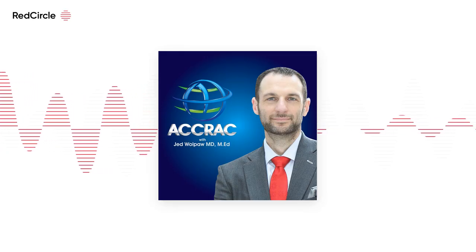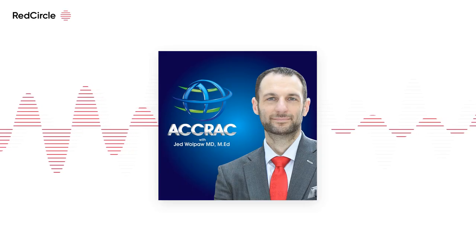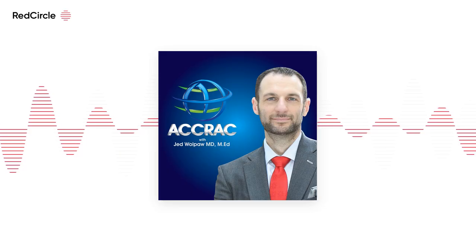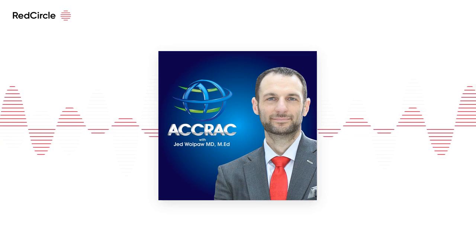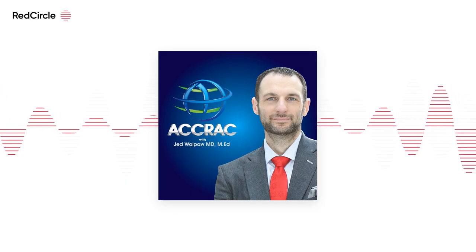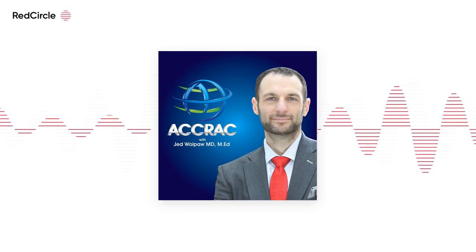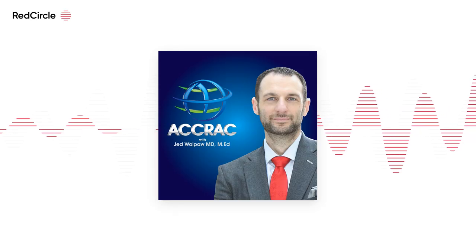What it does is have you do a decremental PEEP trial, just as we mentioned before. You start high, and then you go down to the lowest PEEP level. At each level, it measures the change in impedance that occurs. If you have a device that also knows the pressure, it calculates the compliance of each region of the lung as well as your total respiratory system compliance. When it's measuring the regional changes, it shows you the areas that have worse compliance at high PEEP, and the areas that have worse compliance at low PEEP. So as you titrate the PEEP, when you're done, it analyzes each step and gives you basically a crisscross.